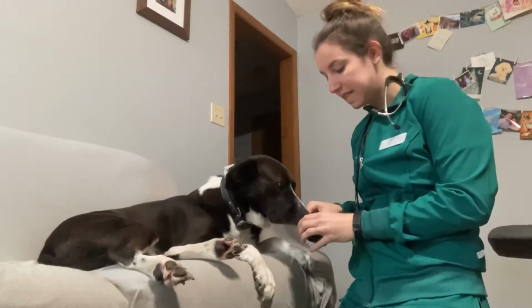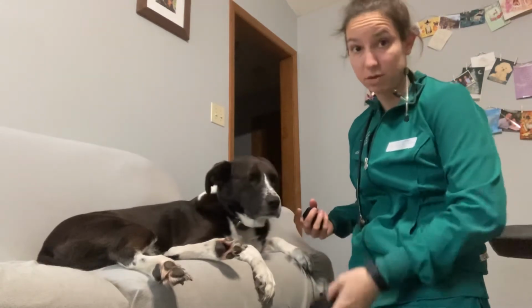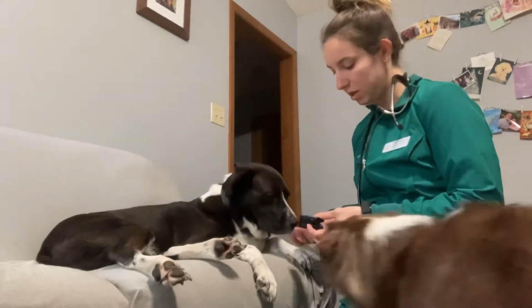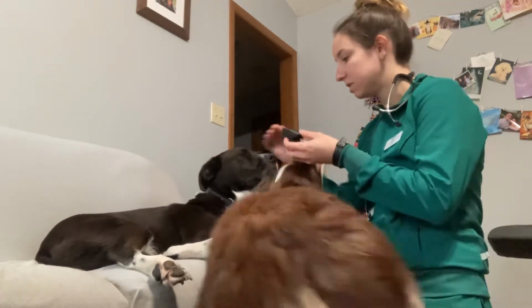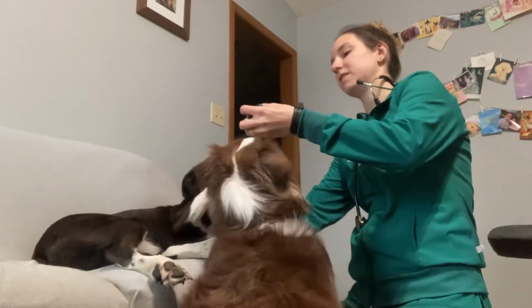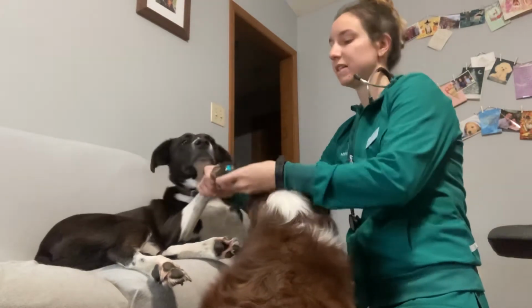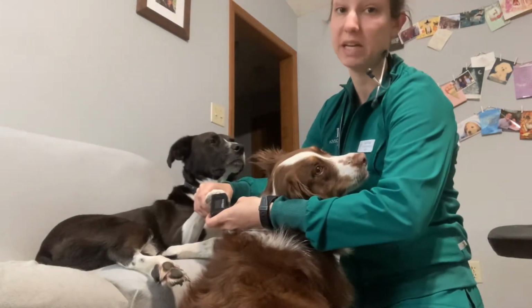Hi. So with Sadie, she is a little bit of a shy dog. I know this because I've known Sadie for so many years. She's a little bit timid. Some of this stuff makes her nervous. I've taken a moment before starting the video to introduce her to the blood pressure cuff, but this is her first time seeing the pulse ox. Now, doggy paws are quite different from human paws. So in applying the pulse ox, I doubt that it will get a reading. And as I look at the screen of my pulse ox, there is no reading.